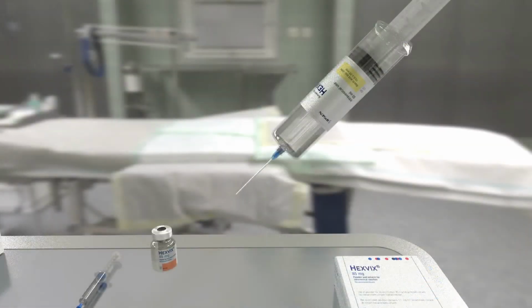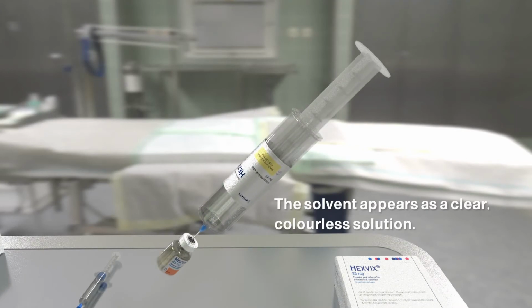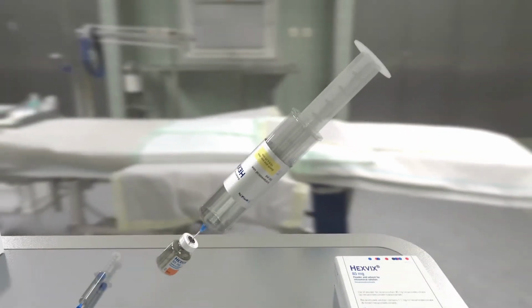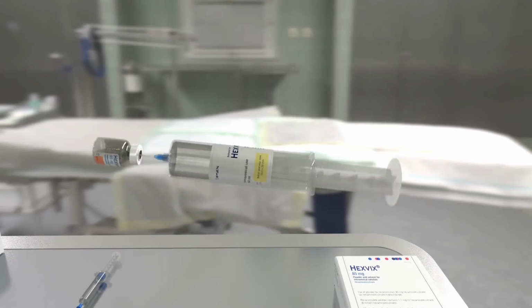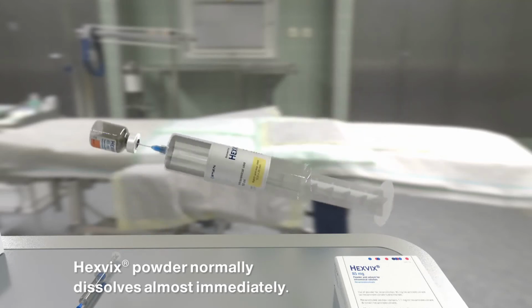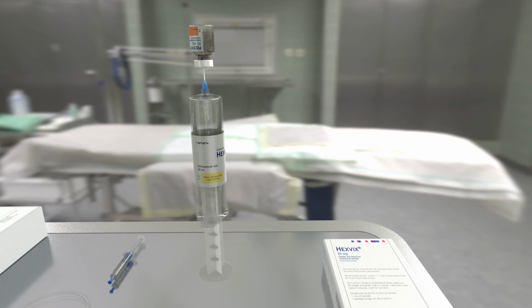Inject about 10 ml of the solvent from the syringe into the vial of Hexvix powder. The vial should be about 3/4 full. Without withdrawing the needle from the vial, hold the powder vial and the syringe in a firm grip and shake gently to ensure complete dissolution. Turn the vial and syringe upside down and withdraw all of the dissolved solution from the powder vial into the syringe.